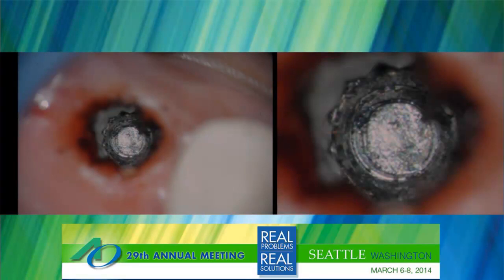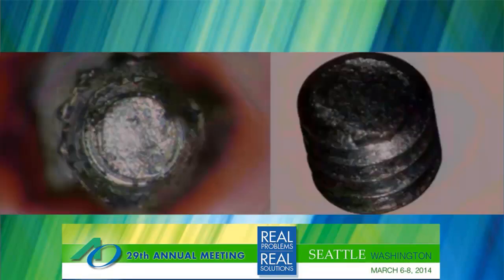But look at what happens when you bump into 25 power. This is the same picture again, just blown up to the angle of view of about 25 power. And now all of a sudden you can see screw threads all along down here, so we know it's below the top of the screw threads. And then here's the leading edge of the screw fragment. Okay. Now with some, you'll know it's a great case because here's the screw in one piece, and you can see what that fragment looked like. You can see that sharp leading edge that's pointing out at us, and you can also see the original roughly 25 power image of that.